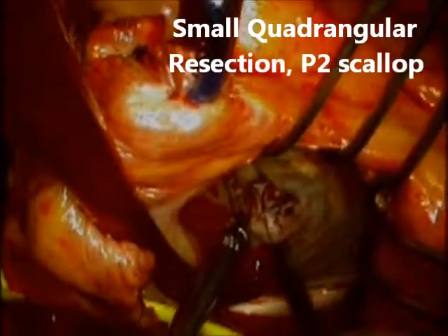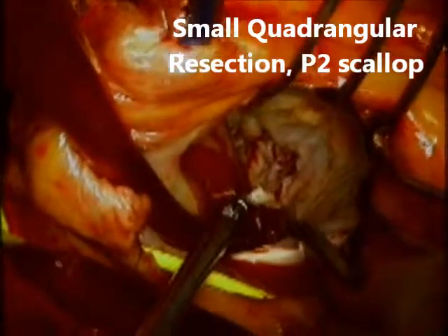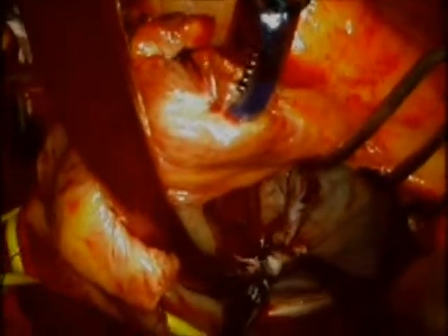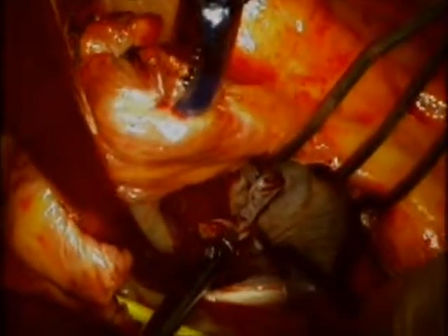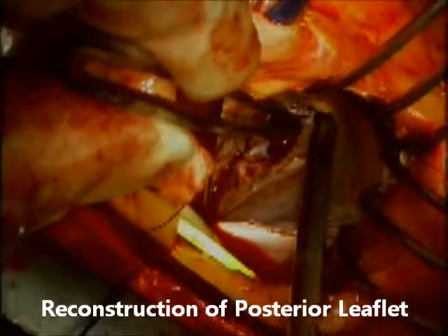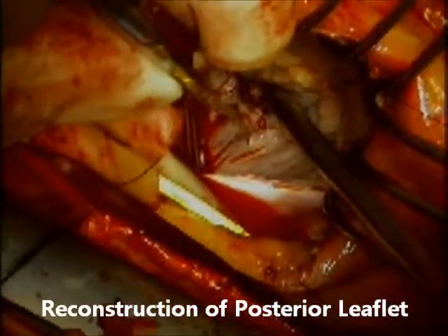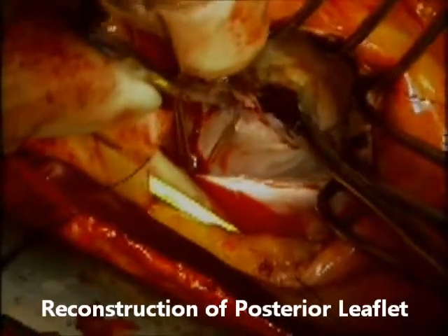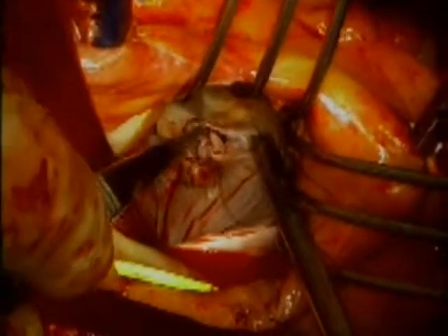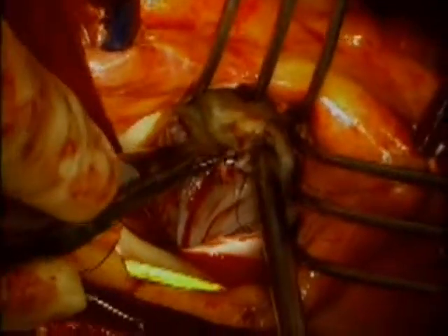We proceed with a small quadrangular — almost a wedge — resection of the P2 scallop, sparing any other chordal attachments from P1 and P3 scallops, which will be useful in keeping the posterior leaflet at the proper level of coaptation. Once this is removed, we reconstruct the gap between the P1 and P3 scallop using figure-of-eight stitches, placing them in a way that inverts the cut edges of P1 and P3 so they stay on the ventricular side of the posterior leaflet, giving a smoother apposition plane between the anterior and posterior leaflet.